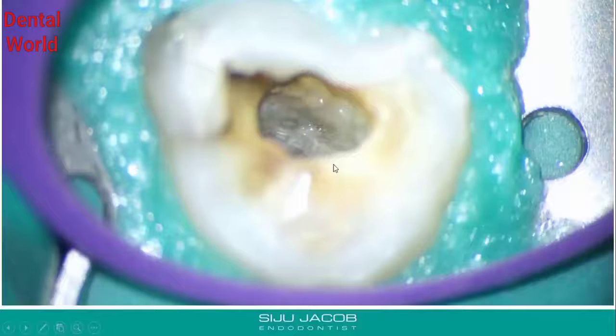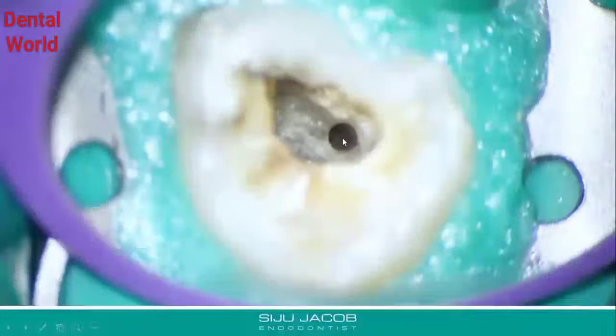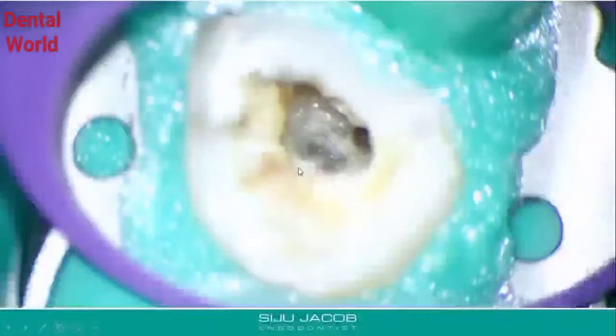So that's what I did. I cleaned this area up, and sure enough, there was a canal there. So once I found one canal, by this time almost an hour had passed by, and we had lost quite a bit of time.